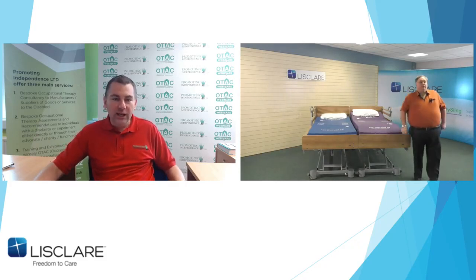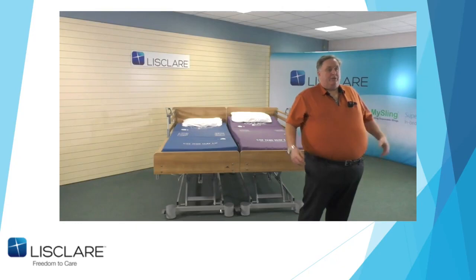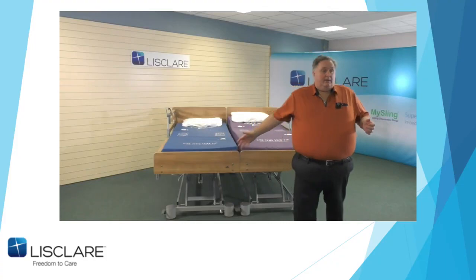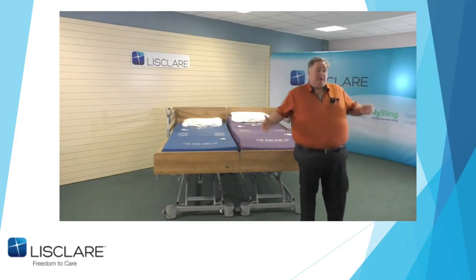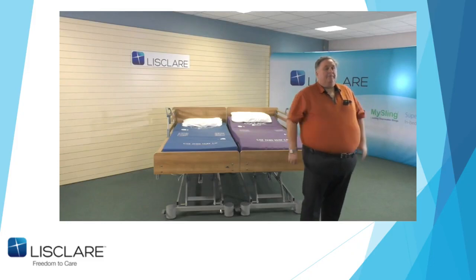Sorry to interrupt. Keith, why would you put that bed in instead of 2 standard hospital beds that you've got in the joint equipment stores? Well, the 2 hospital beds you can put in, but if there's 2 patients, they're in 2 separate beds. They can't be butted together. You've separated them. The whole point about this is this looks, pardon the expression, like a couple's bed. 2 nursing beds, that's the option. But you're going to have the stress of a family thinking you've just separated them, and they don't want the next 15 to 20 or 30 years of their life being in 2 single nursing beds that are basically like hospitals. It's the whole ethos of long-term care.